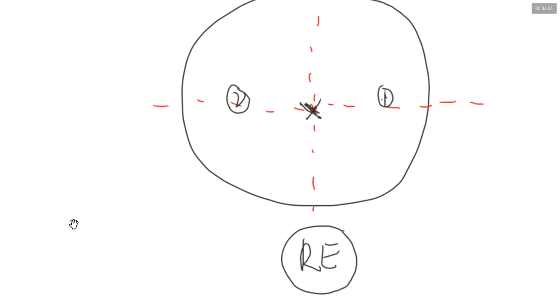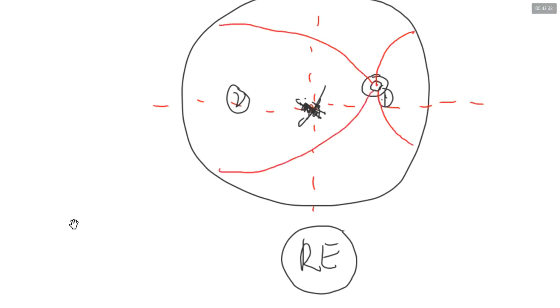So we see that the macula is inferior temporal to the disc. Since the center is the macula over here, we go slightly nasal and superior. So usually you should draw your optic disc over here. Then for the optic disc, you have the disc edge and also the cup edge, and then come the vessels going out from the optic disc.